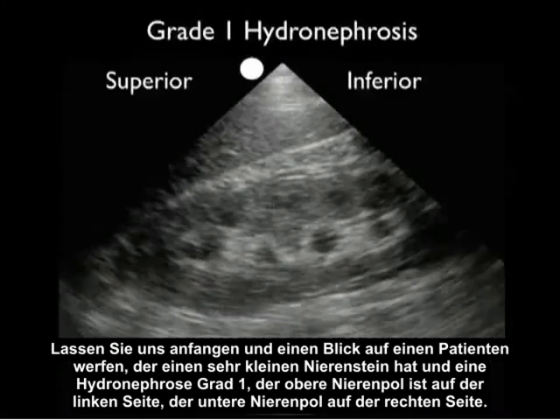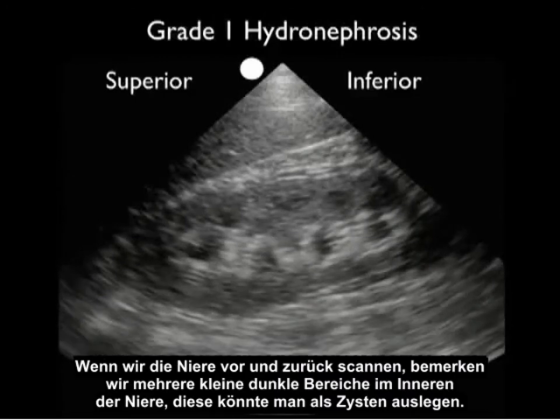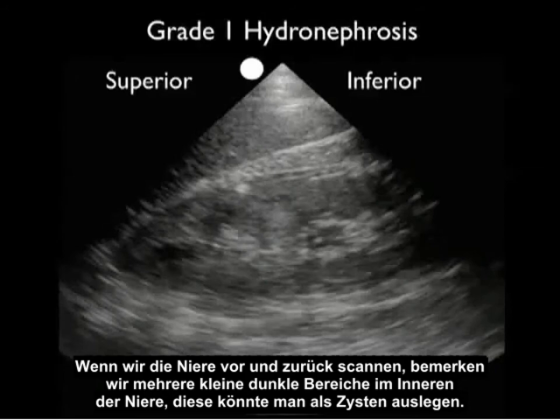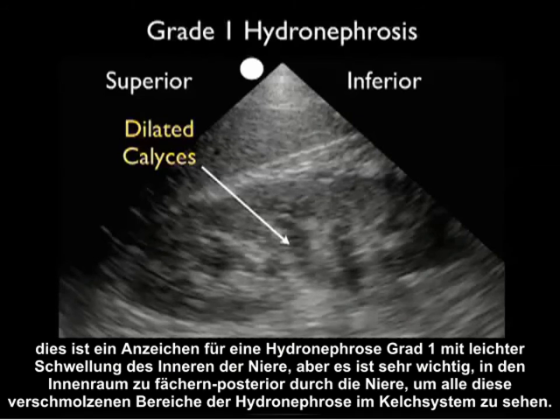Let's look at a patient who presented with a very small kidney stone and grade one hydronephrosis. Superior pole is to the left, inferior pole to the right. As we scan back and forth through the kidney, we note multiple small dark areas within the interior — these could be construed as cysts. However, as we scan up and down through the kidney, we can see that they all coalesce to form dilated calyces — the signature of grade one hydronephrosis with mild swelling of the interior. It's very important to fan anterior to posterior through the kidney to confirm that all these areas coalesce into the calyceal region.